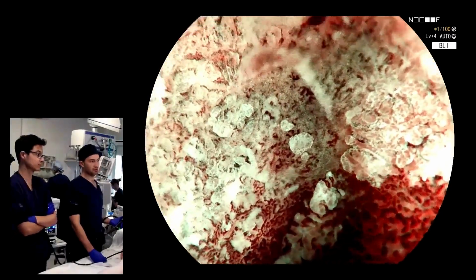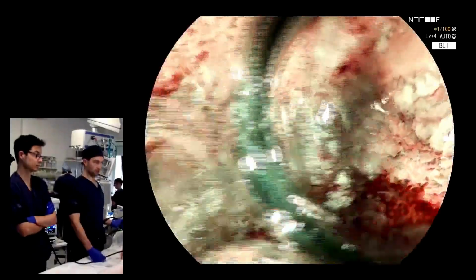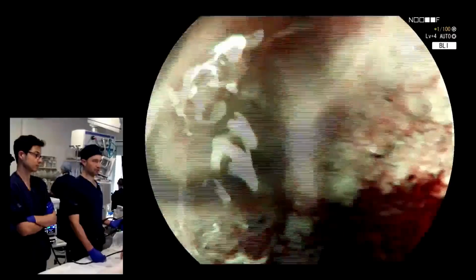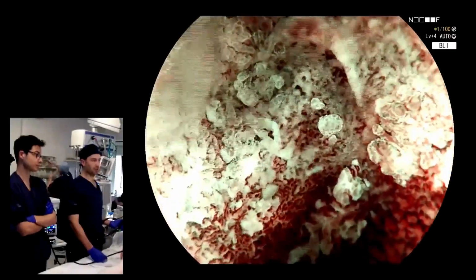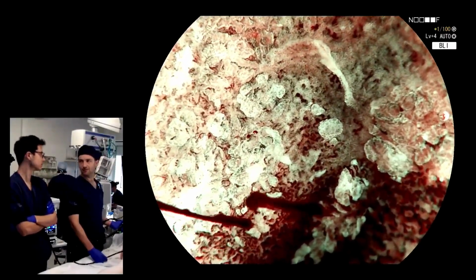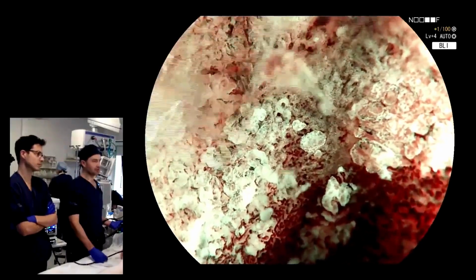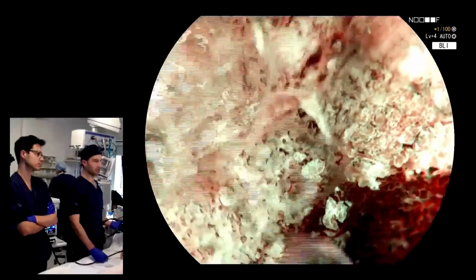So I think this can be quite confusing to people, can't it? Because when we are talking about JNet, well, it's basically about regularity, right? And then we say to people, you look for a regular or an irregular pattern, right? People look at the bottom and they appreciate what you're saying, but they look at the top and they think, well, there isn't anything there, so maybe that's just normal. And I think it's very important what you've said, that it's almost amorphous there, isn't it? You can see the vascular pattern. I mean, they are there, but they are very spread out and all over the place.